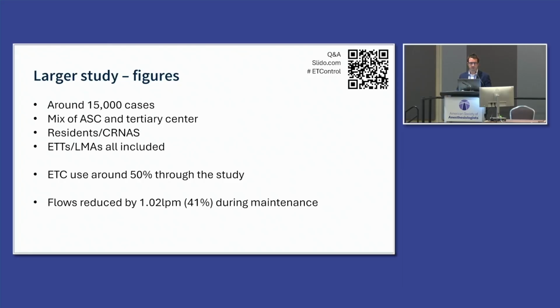What we found was that the provider in the room was almost the key differentiator between whether or not it was turned on or not. Now that might seem obvious, but you might have thought that maybe people weren't turning it on in like otolaryngology cases, or there were certain types of cases that people didn't want to use it on. But actually, no, it's just the provider. And if the provider is educated and knows what it does, then they turn it on. If they don't know what it is, and they're the sort of person that doesn't just press random buttons to see what happens, then it stays off.